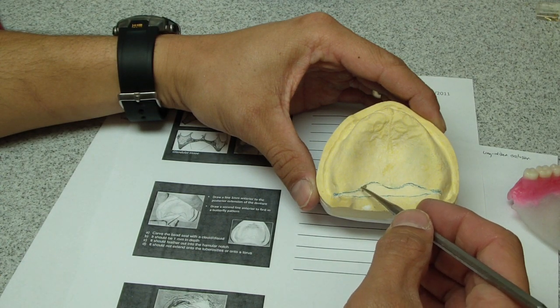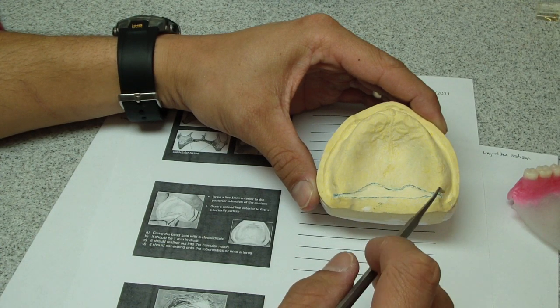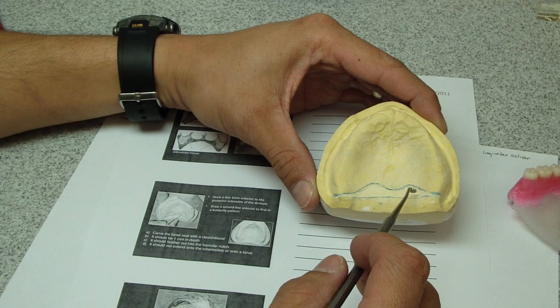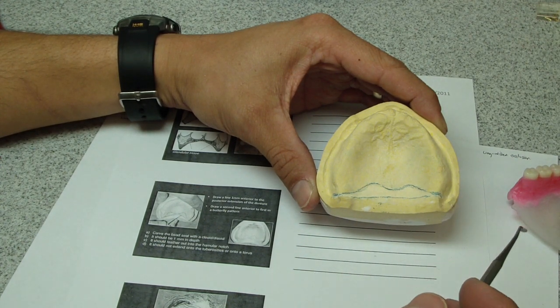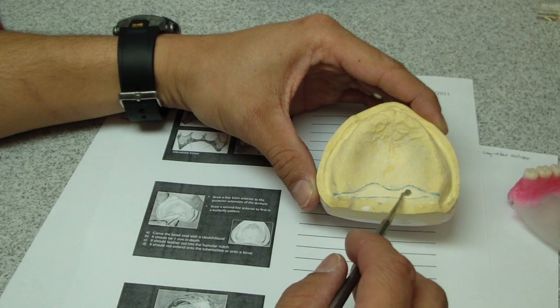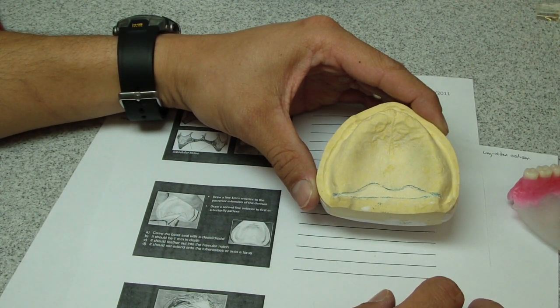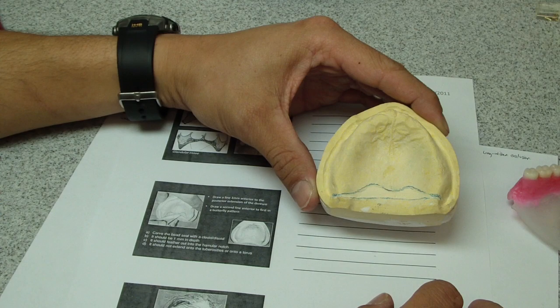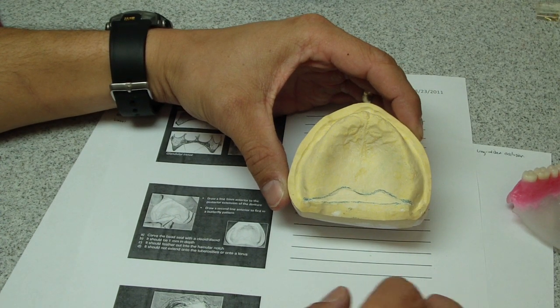I mean, make it constant, but one of the important things is to feather out as you get towards the hamular notch, and don't extend it onto the tuberosity or onto a torus. So this, once we process it, will aid in getting that beautiful refrigerator door seal. So it'll take 3 to 4 men to get this denture out of the patient's mouth once processed. Cheers.